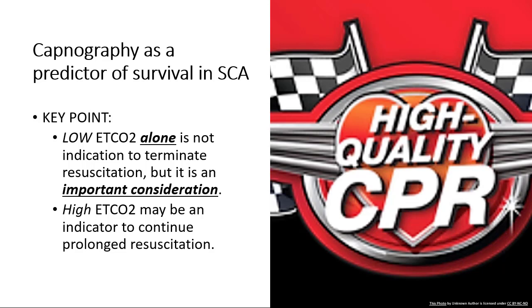So I want to say that again: even after 20, 30, 40, 50, 60 minutes, if you have a good end-tidal CO2, greater than, I'll say 25, but definitely in the 30 to 35, 45 range, you still have metabolic activity. Really strongly consider prolonged resuscitation, even if they're asystolic, even if they're VFib, whatever it is, no matter how tired you are. And here's why.